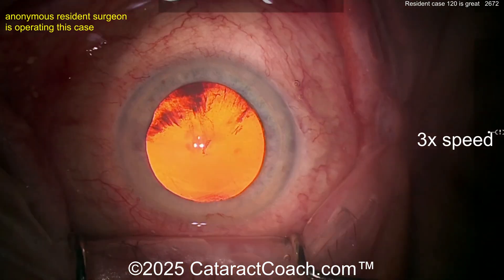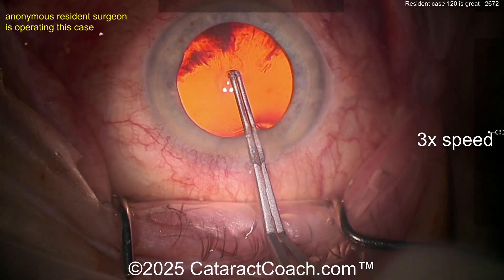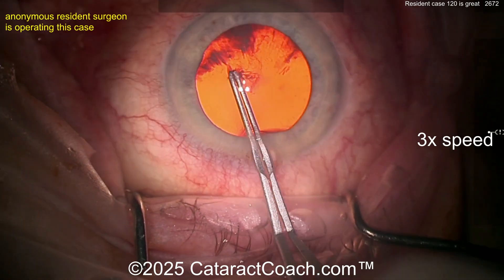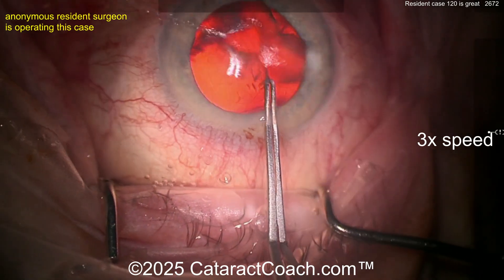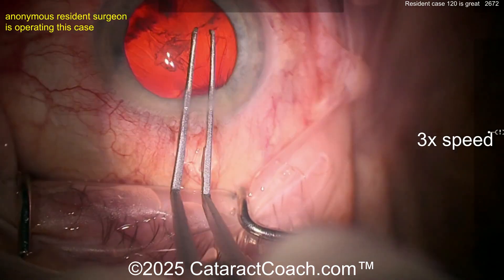Let's see the rhexis. The video is definitely sped up, so that's okay. Remember, you can use the YouTube function to put it at half speed or even quarter speed if you want. Here's the rhexis — I like that, using just the forceps. Good pivoting technique: pivot, pivot, pivot. That looks pretty good, getting that going around — pretty reasonable.